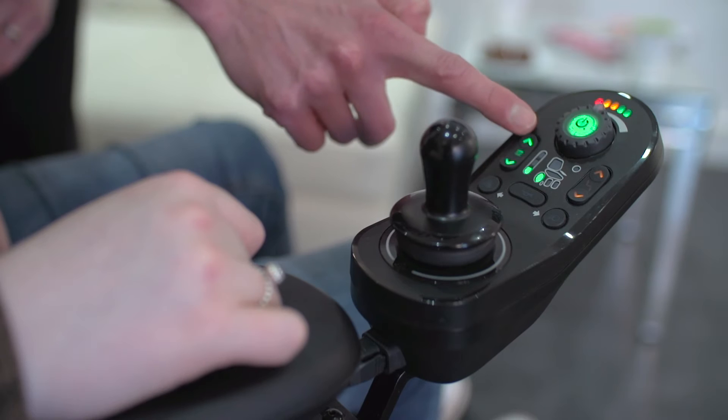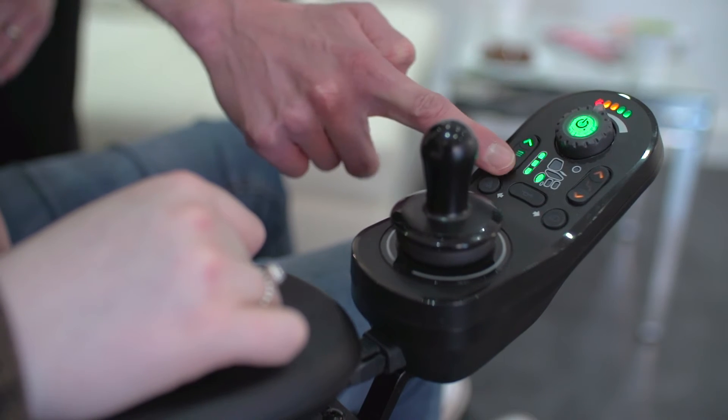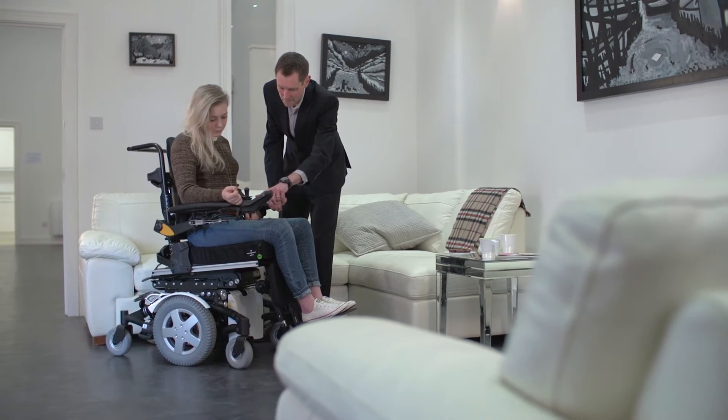The drive button accesses different drive functions that can be customised by the power chair provider to suit the user. Functions such as indoor and outdoor can be accessed here.